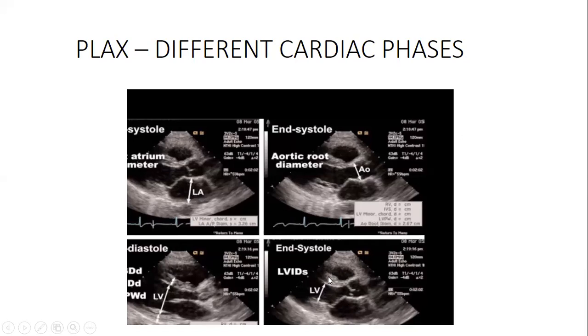Now imagine if this was already pathological. It simply means the cavity is going to reduce even more, because during systole it will thicken with the already thickened mass, including in diastole. So it will be very thick.